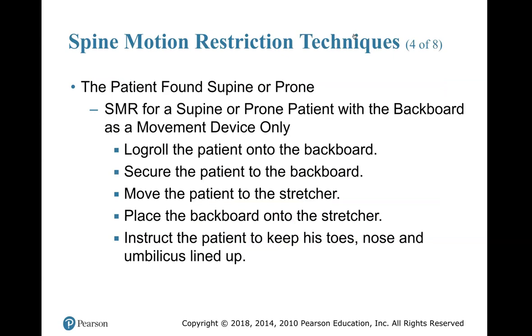All right. Spine motion restriction for a supine or prone patient with the backboard as a movement device only. Log roll the patient on the backboard, secure the patient to the backboard, move the patient to the stretcher, place the backboard on the stretcher, instruct the patient to keep his toes, nose, and umbilicus lined up.